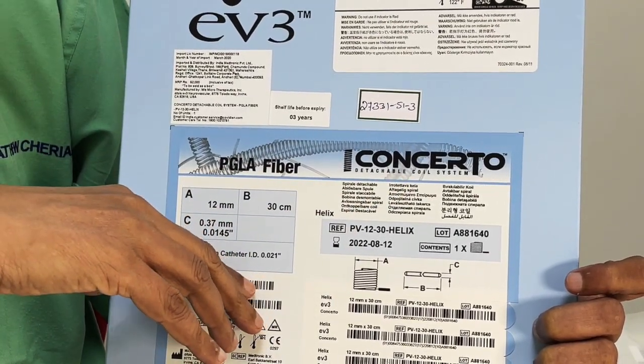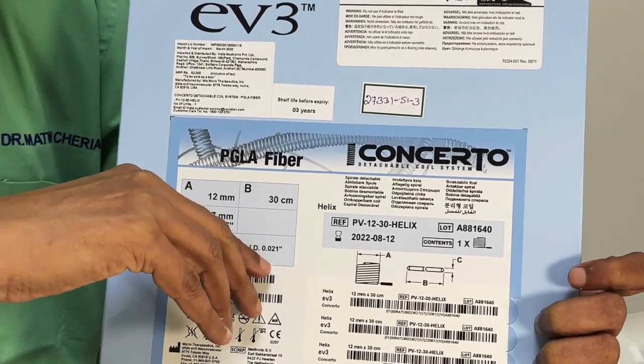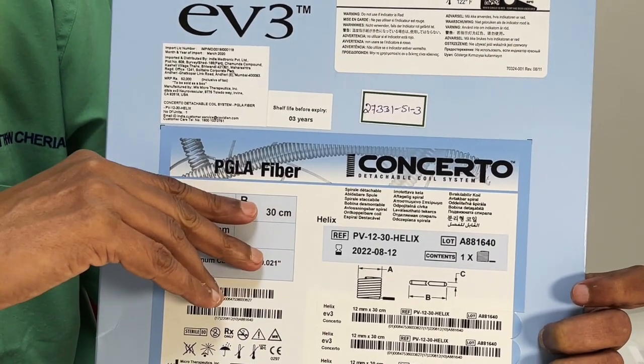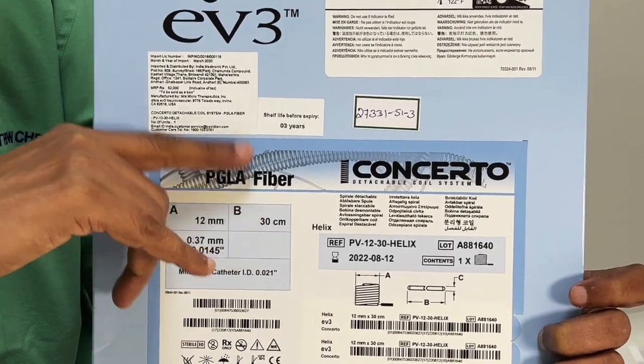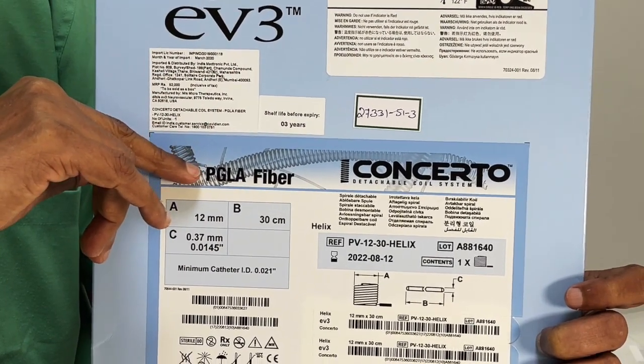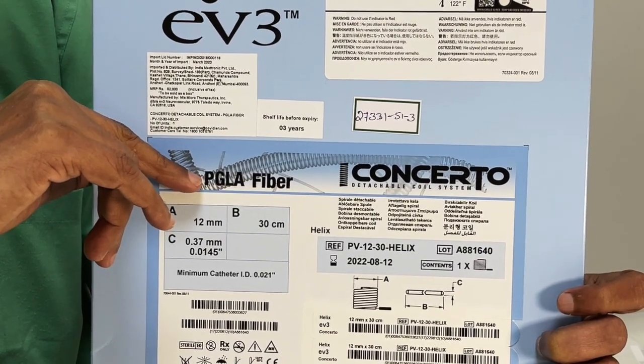So these are okay when you want to occupy space. And again, I said, other than CCF, we have not been using it anywhere, but you can technically use it in any place. And this comes from Medtronic now, because Medtronic has purchased. And the detachable system is also exactly the same detachable system that we have for the EV3, which is mechanical.